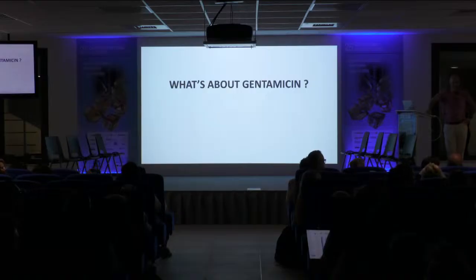So any question? Yesterday I chose to perform my surgery by the posterior approach because I prepare the field for the cochlear implant. I don't perform the posterior tympanotomy because I don't need it. The incus is in place, I let it in place. I look for the third portion of the facial nerve and dissect all the mastoid. You have the location for the processor at the upper part of my field. So if I come back to this patient to insert a cochlear implant, it will be very easy. And I put some muscle in the cavity of the labyrinthectomy to be sure that the area of the cochlea will not be invaded by fibrous tissue, I hope.